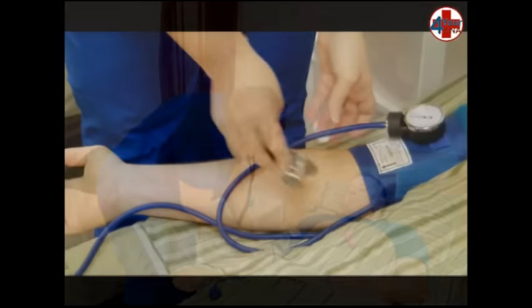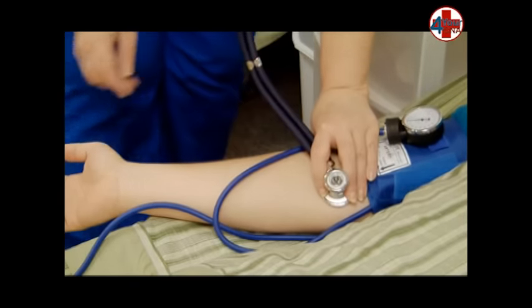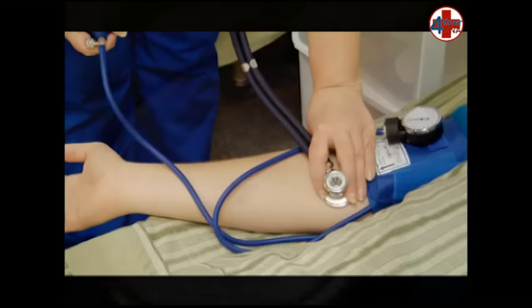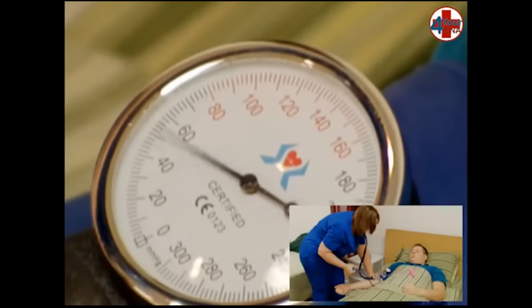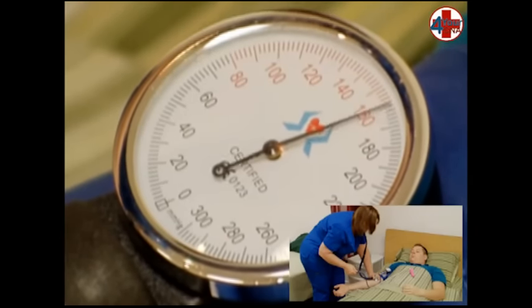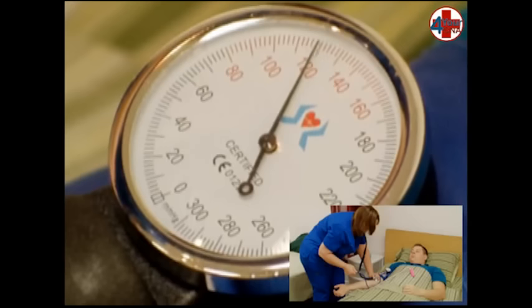Place the earpieces in your ear and the larger diaphragm over the brachial artery. The stethoscope should be held in place with your non-dominant hand. Hold the bulb assembly in your dominant hand, turn the valve to the right to close it and inflate it to 180. Open the valve slightly to the left to let air out so that the needle descends at a nice controlled rate.